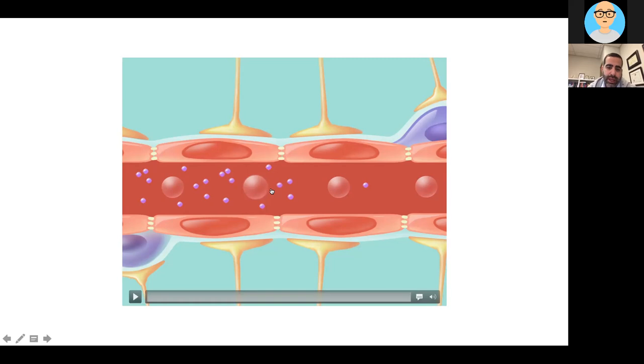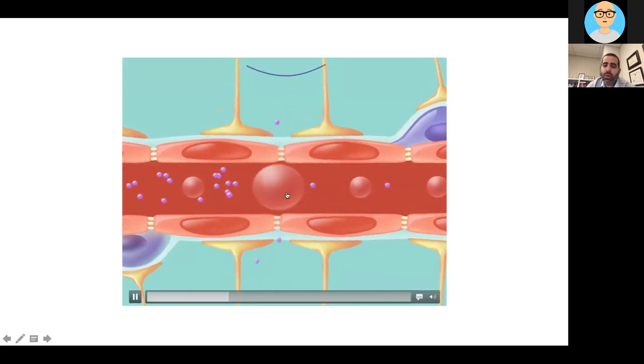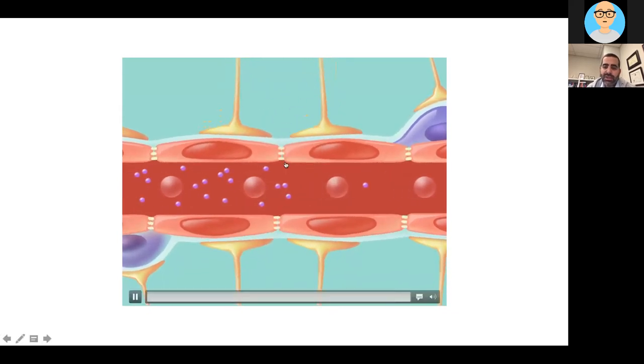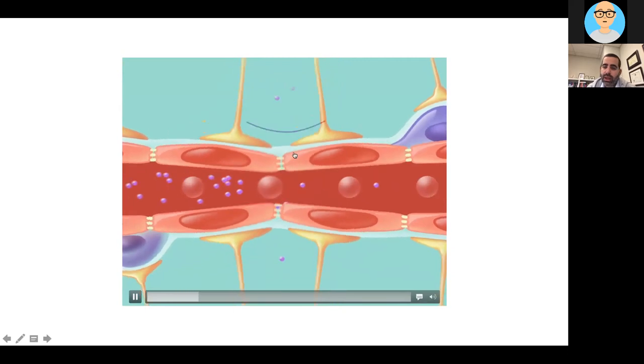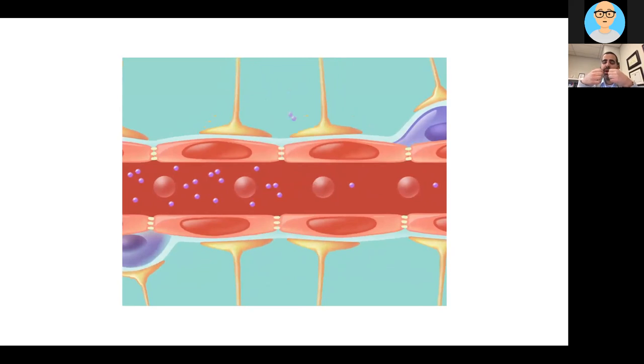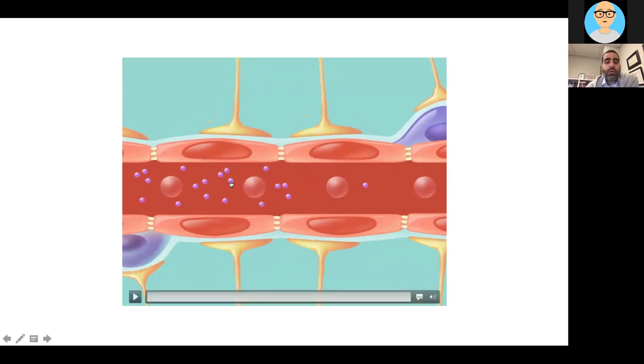You can imagine that these red balls are a contrast agent that we actually inject patients with. It's microscopic bubbles that circulate throughout the body. Then they get to the brain, and when they're in the brain, they're exposed to focused ultrasound, and they oscillate very quickly, 500,000 times a second. They cause a physical pulling apart of the cells making up the blood-brain barrier, so it's a mechanical disruptive force. That opening of the blood-brain barrier creates a kind of window for these purple compounds, which can be any drug that you want to deliver, to get into the brain.